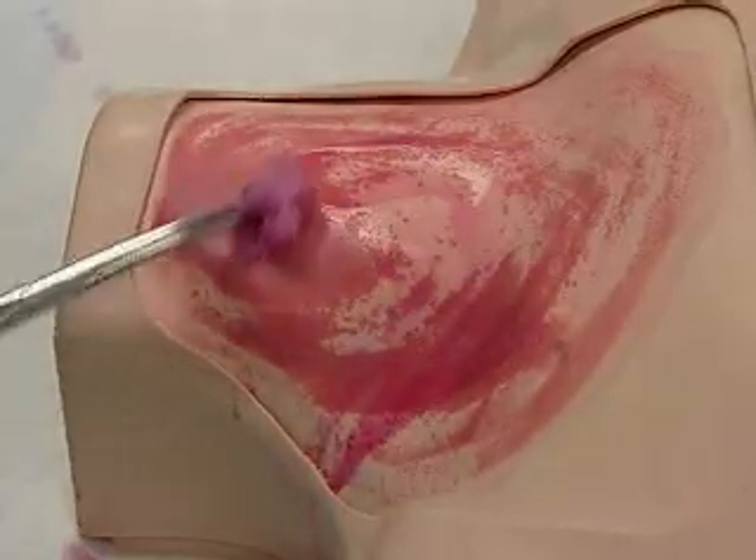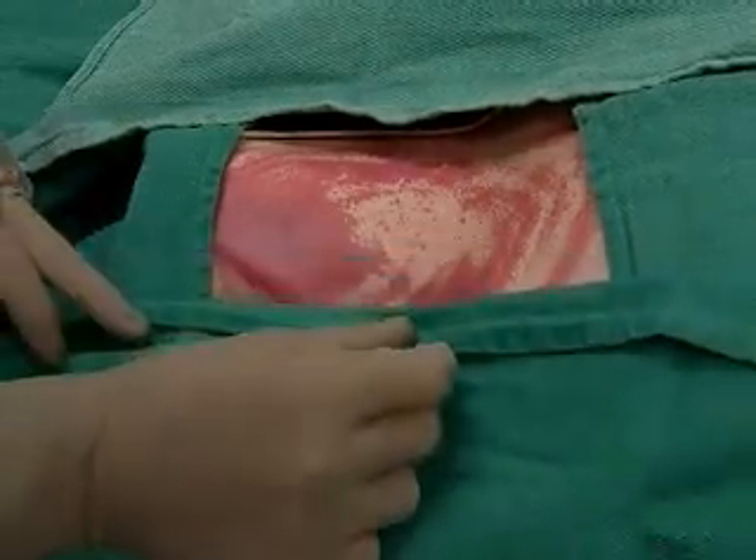Our patient should be in Trendelenburg position with head turned slightly to the left, and we apply sterile drapes around the field.